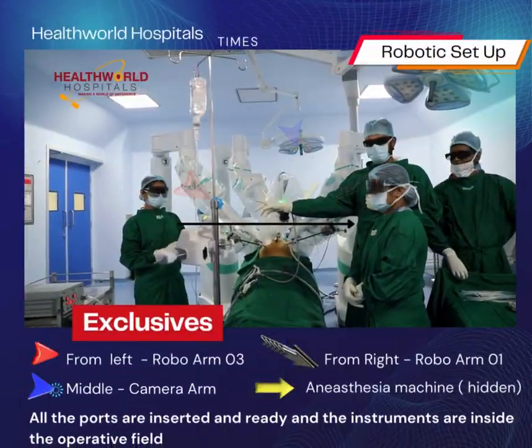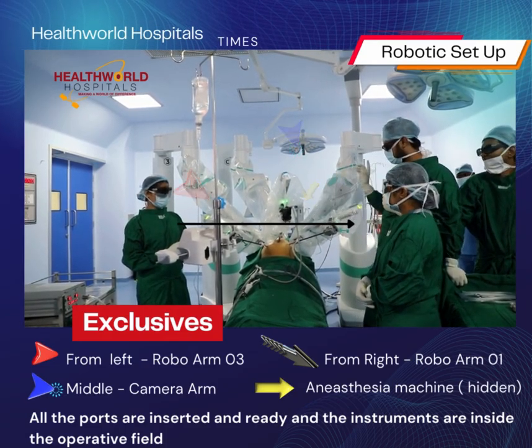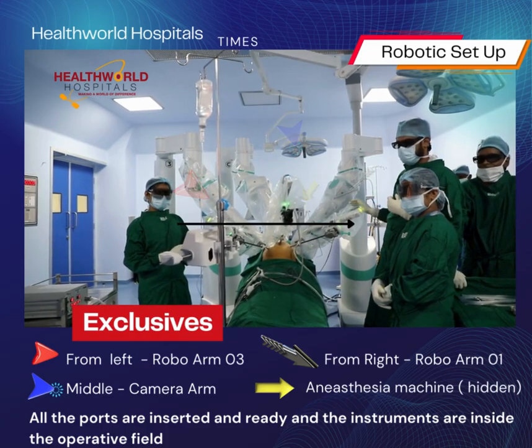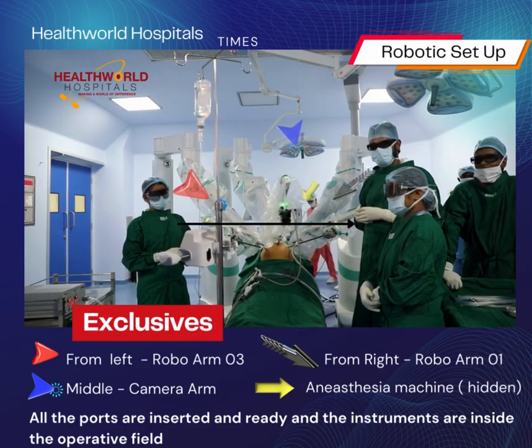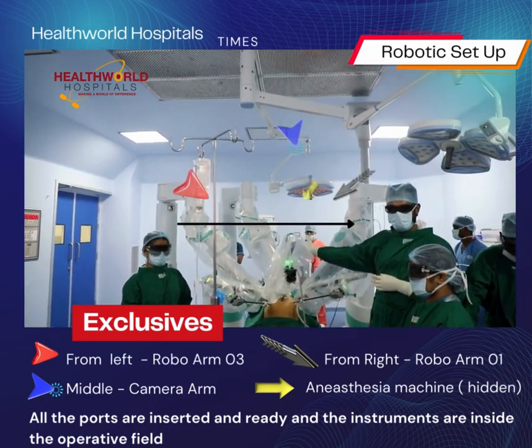On the left hand side, this is the camera arm, and this is another robot — number one. At the head end, there is an anesthesia machine.